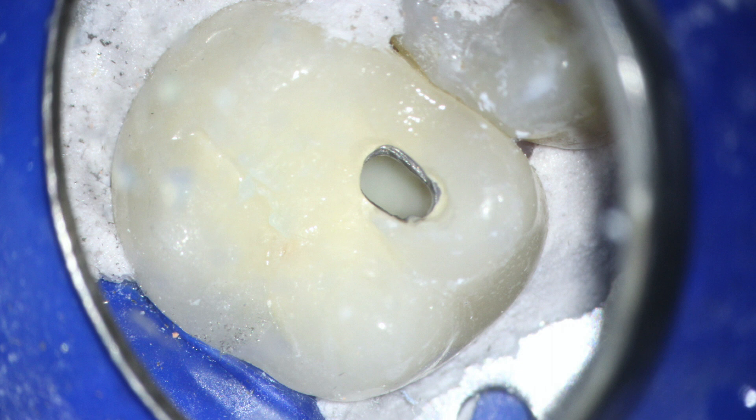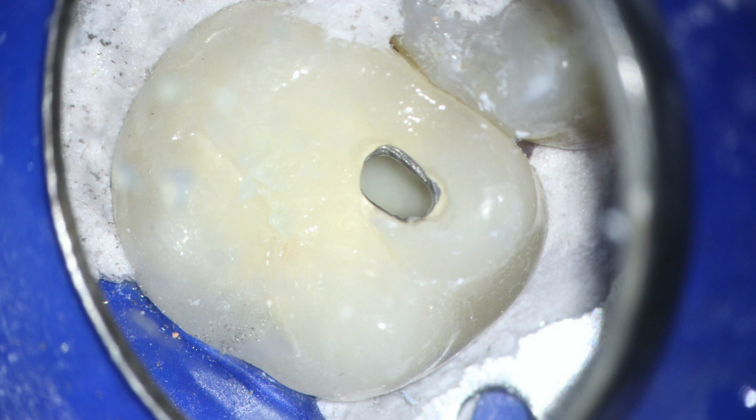I was happy with my cone fit image, so I went ahead with the final obturation — taking a heat source and searing off the gutta percha at the level of the orifice, using a 5-7 plugger to condense and compact the obturation material in the coronal third. I generally like to place a final restoration, but if I'm working with a restorative dentist who prefers to place it, I'll always place a minimum of a 3mm thick bonded orifice barrier to protect that work. Then I'll close the case with a little piece of endodontic sponge and Cavit, and send the patient back to the restorative dentist for the final restoration.